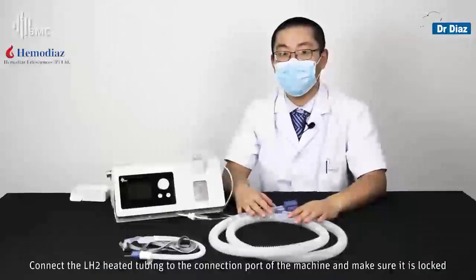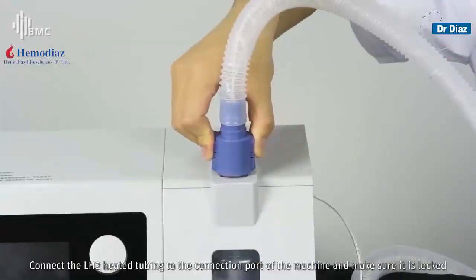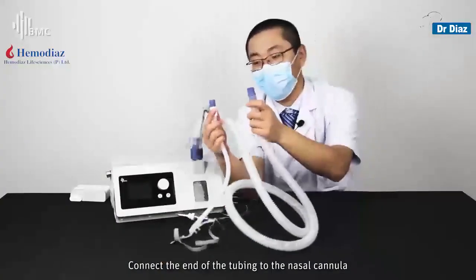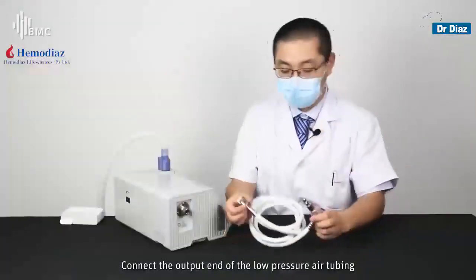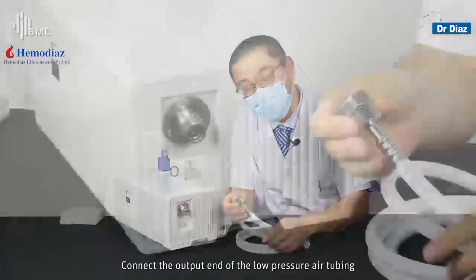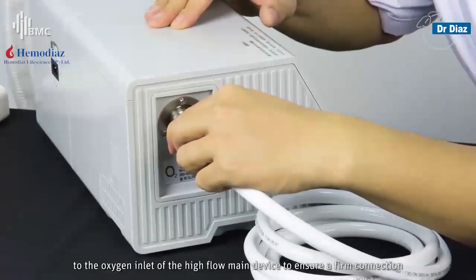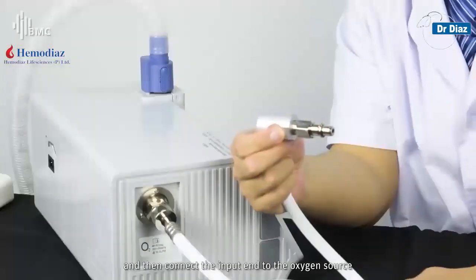Connect the LH2 heated tubing to the connection port of the machine and make sure it is locked. Connect the end of the tubing to the nasal cannula. Connect the output end of the low pressure air tubing to the oxygen inlet of the high-flow main device to ensure a firm connection, and then connect the input end to the oxygen source.